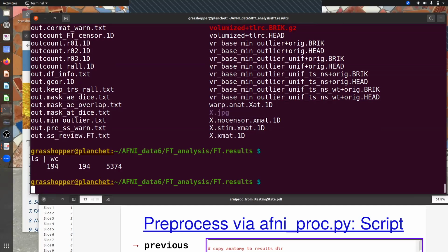That's the idealized thing. The more you're in analysis, you realize you want to make sure that all those steps that we asked the program to do got done right. And so you want to be able to check that if you're trying to align 2 things, they actually got aligned, right? Just because the program didn't crash doesn't mean it did that right. Or you want to make sure that the subject didn't move too much, or things like that, or there aren't other mathematical problems here. So we tend to keep a lot of intermediate data. So once you've processed it, you can check anything that you have a question about.